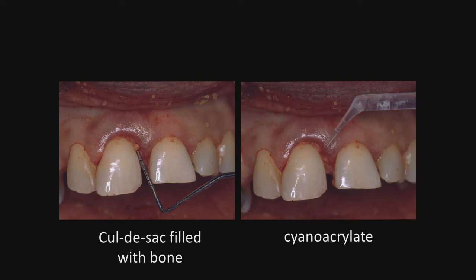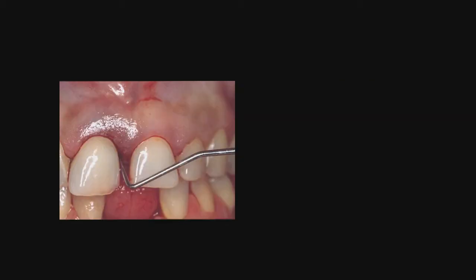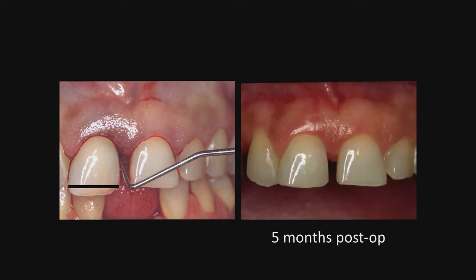Not on this case, but later on, I would take and cut off a small wedge of a 2x2 sponge, place it in the diastema area, and let that stay for as long as it will to keep food from packing into the area. And sometimes that will stay in place 4 to 6 weeks, and that's all right. So this is our pre-op view, and this is the view about 5 months later. And you will note that we have shortened the incisal edge, as you can see from the black line on the left.